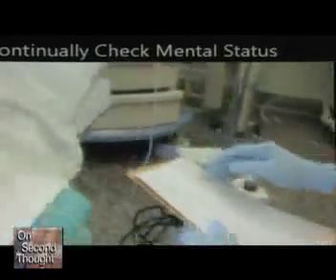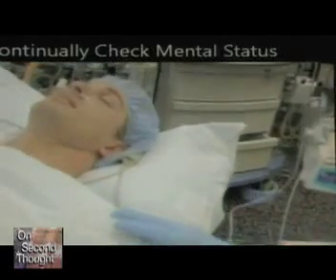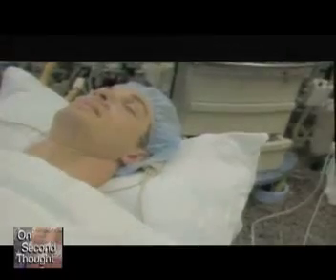Stop. You'll notice that Professor Hung is sitting right next to the patient. The anesthesiologist is in close proximity to the patient. How close? You can reach out and touch the patient throughout the case. In this case, he's tapping the patient's shoulder to see if the patient is feeling the effects of propofol. Are you feeling sleepy yet? The anesthesiologist has this moment-by-moment connection to the patient constantly throughout the procedure. Please continue. So, patient seems to be pretty sleepy here.